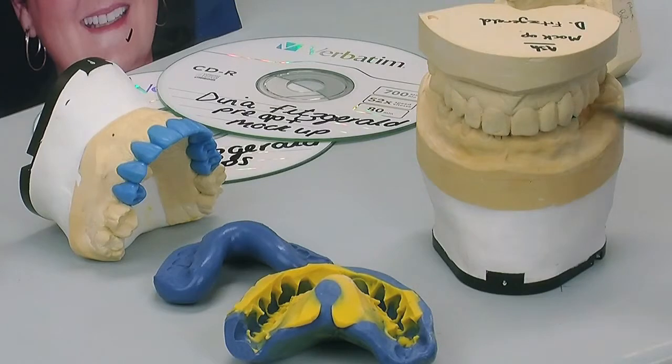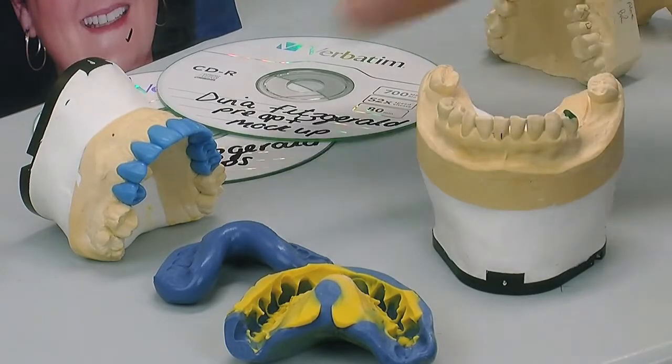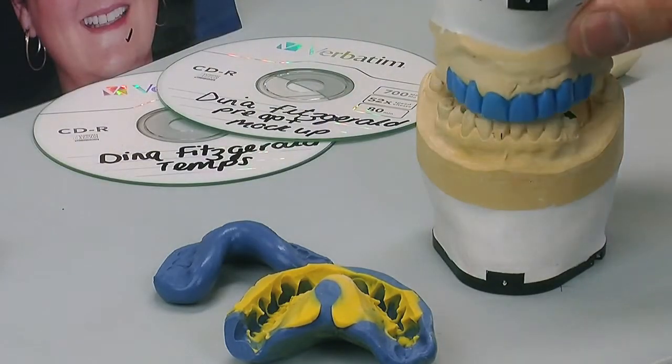We've built out this buccal corridor here on the left-hand side and dropped it down, which was necessary. We've moved the centre line a little bit and given it a much more fuller smile, and from this we do our diagnostic wax-up.